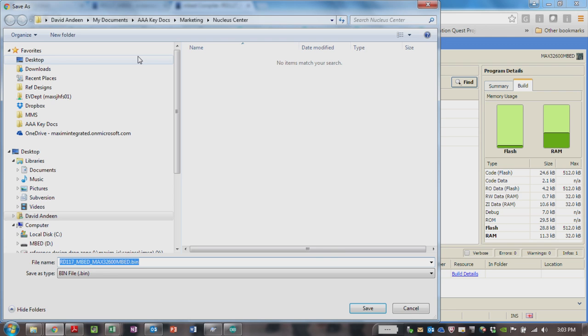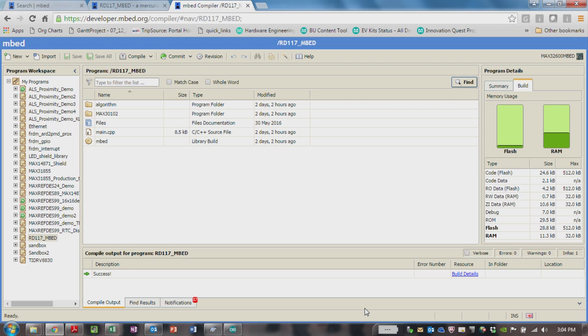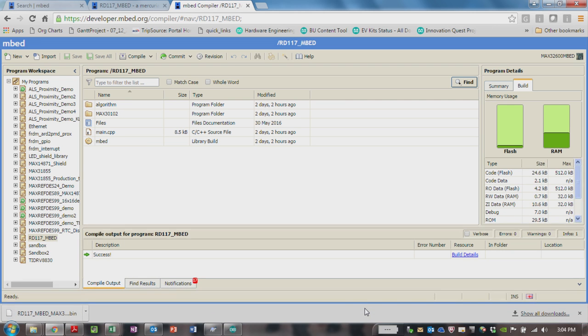Okay, so then I configure my computer so I can just save the file right away to my embed drive. Platform, embed drive. So we just click on that guy, save it, and we should be good. We should have downloaded it and everything, right? Right. Okay. It's just that easy.